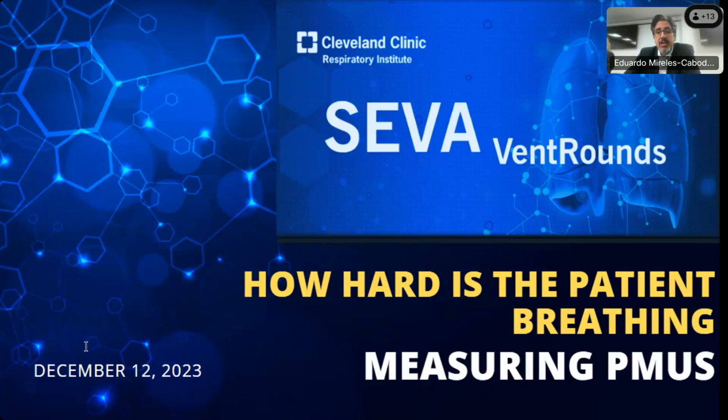Rob? That's right. All righty. And I see a comment from Ariel about PC-IMV-SS and PC-IMV-2SS as also examples, of course, of this constant relationship. Thank you, Ariel, for putting that there.